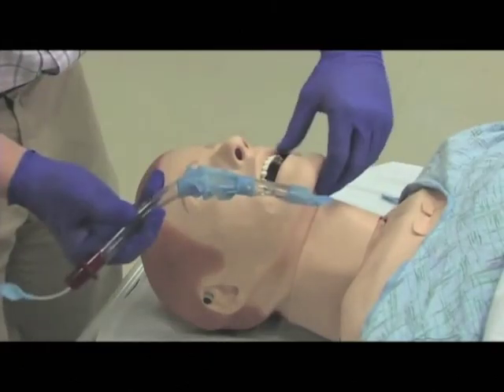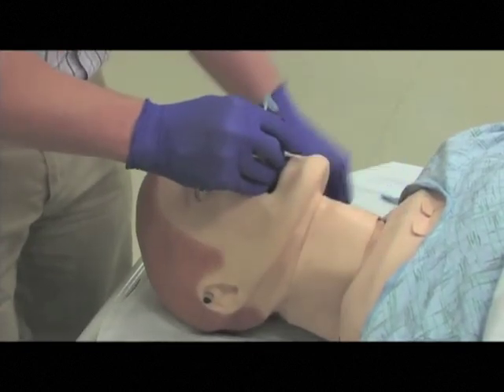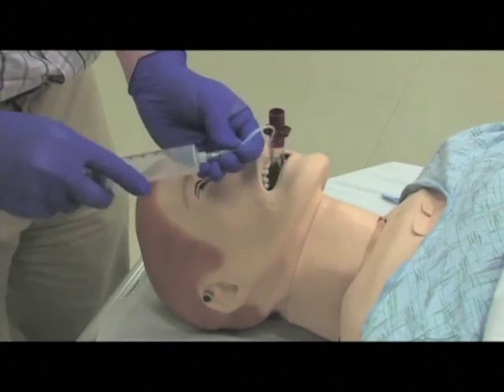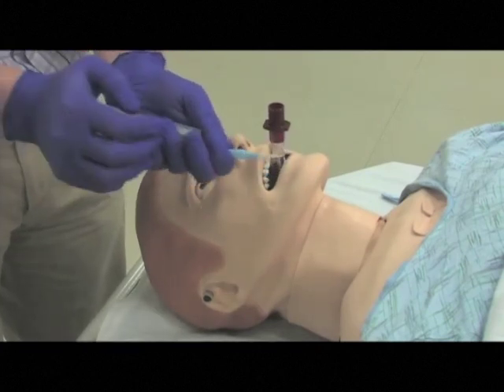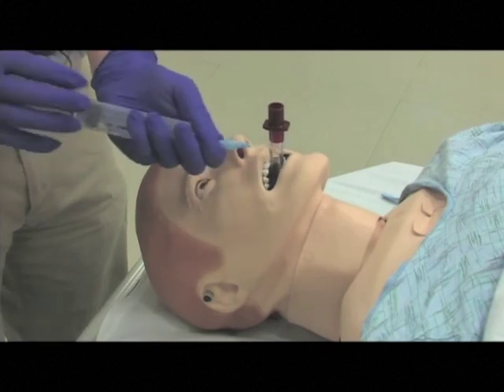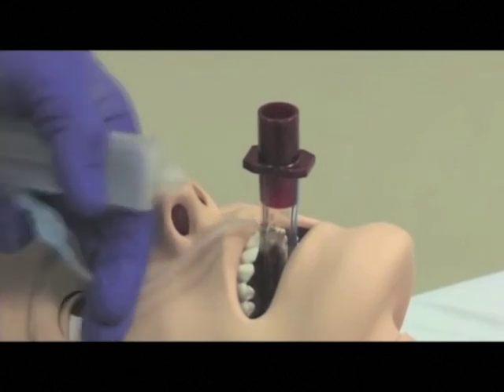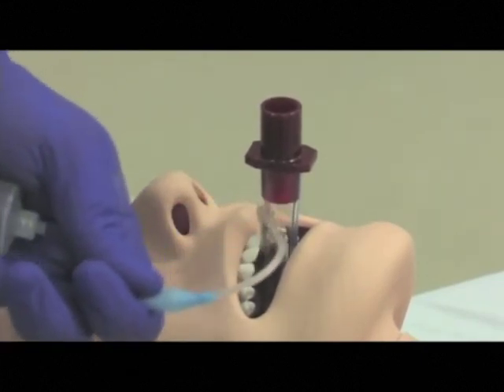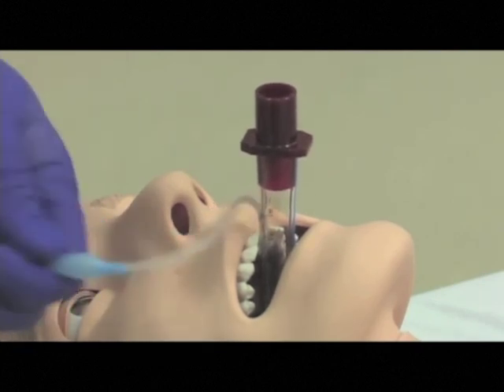Let's look at a King LT insertion. So I'm going to open the patient's airway up here, place the King LT until it's seated. Use a large syringe. In this case, a 60 ml syringe would have been better. You could use a smaller one if that's all you have. And notice as I inflate that the tube is elevating towards the ceiling. Let's just focus on the tube to see what's happening there. So again, inflating, the tube's rising towards the ceiling, and that rise indicates that it's placed in the correct position.